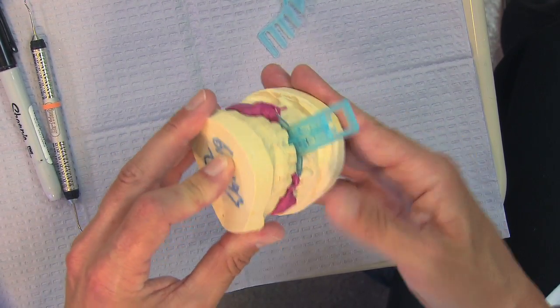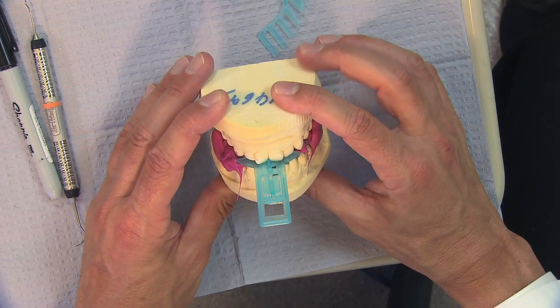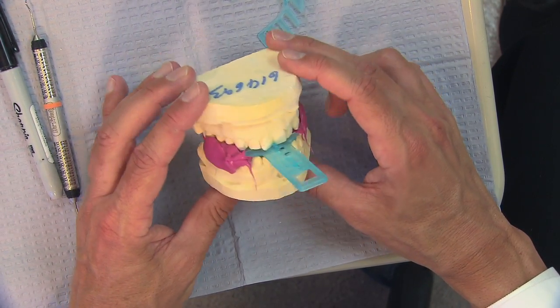And then the lower as well. And then mount the cast with this. And this is going to give us our starting anterior position.